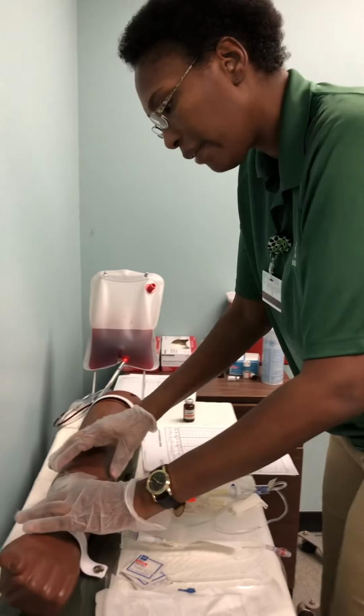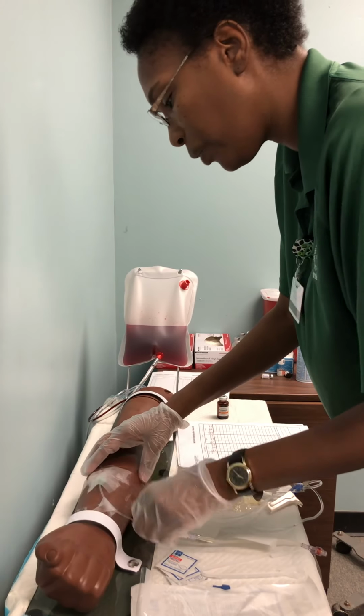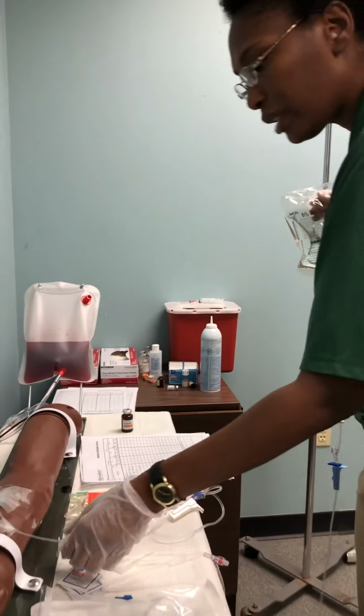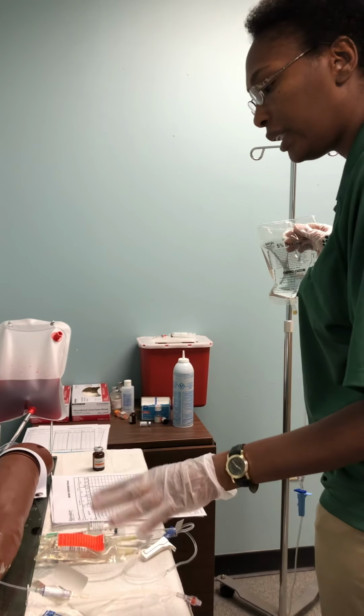And I will check the site for any signs of tenderness. Are you having any pain in this area? No. Any redness or swelling? I don't see any. I will lower my primary bag and look for flashback. I do have flashback, so the IV is flowing properly and it is patent.